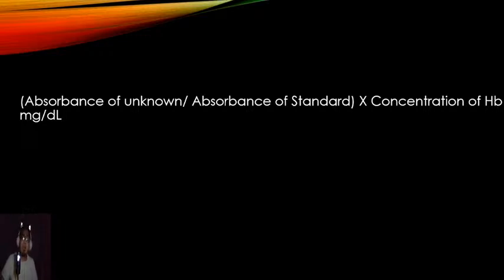You're going to see why I keep an emphasis on writing the formula for every type of analyte that you're going to encounter today. So it's not just for hemoglobin. There's also corrective calculations for retics, corrected reticulocyte count, absolute counts. So be mindful of those things.